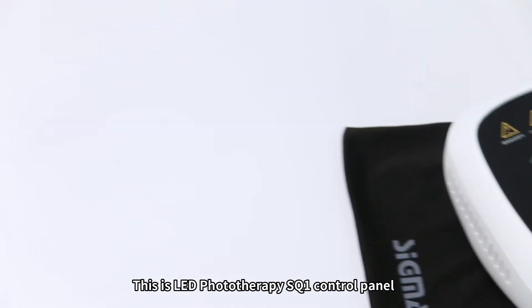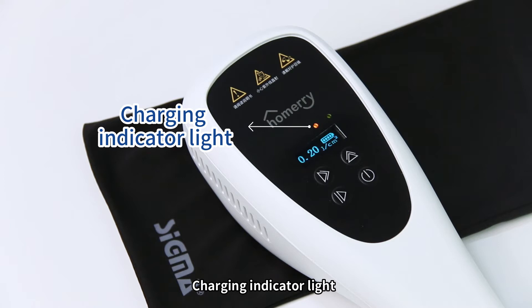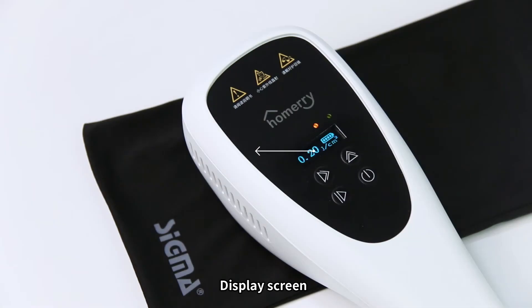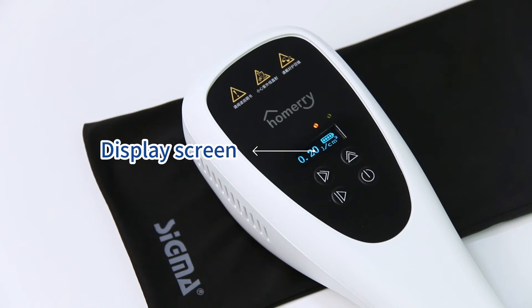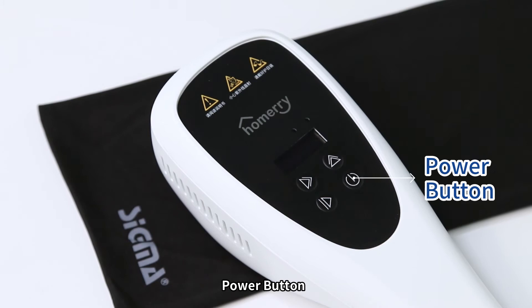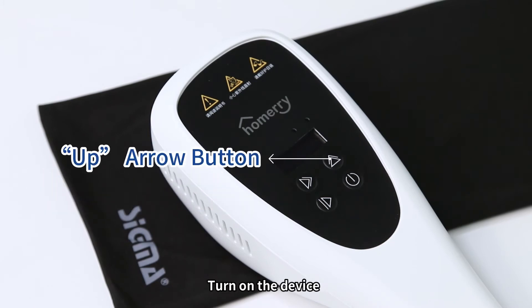This is the LED Phototherapy SQ1 Control Panel. It features a Charging Indicator Light, Working Indicator Light, and Display Screen. There are four function buttons: Power Button, Start/Pause Button, Right Arrow Button, and Up Arrow Button.